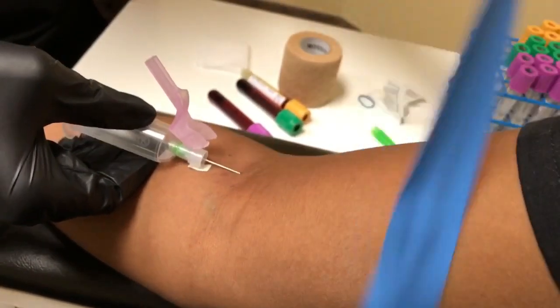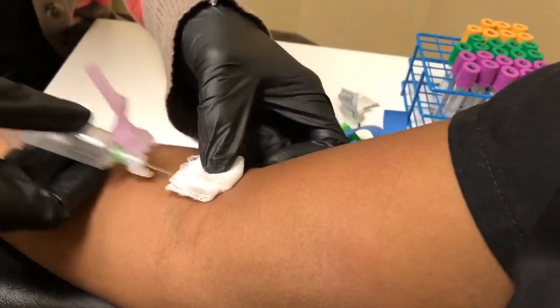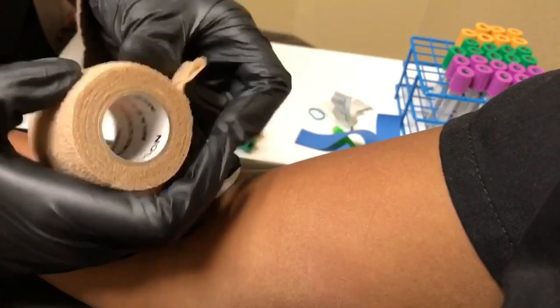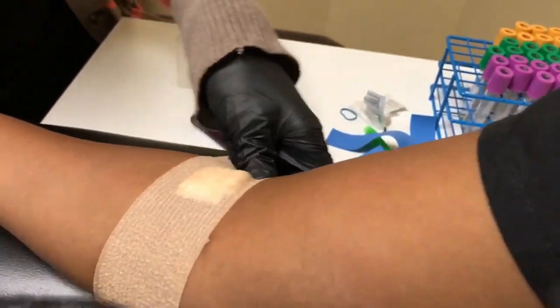We're going to pop the tourniquet. Keeping the needle steady, make sure it doesn't come out. We're going to ask them to apply pressure. She's holding the camera, so I'm going to do this for her. The pressure is going to activate the platelets, which is going to stop the patient from bleeding and prevent any bruising. I usually just ask them to keep it on for about 20 minutes.